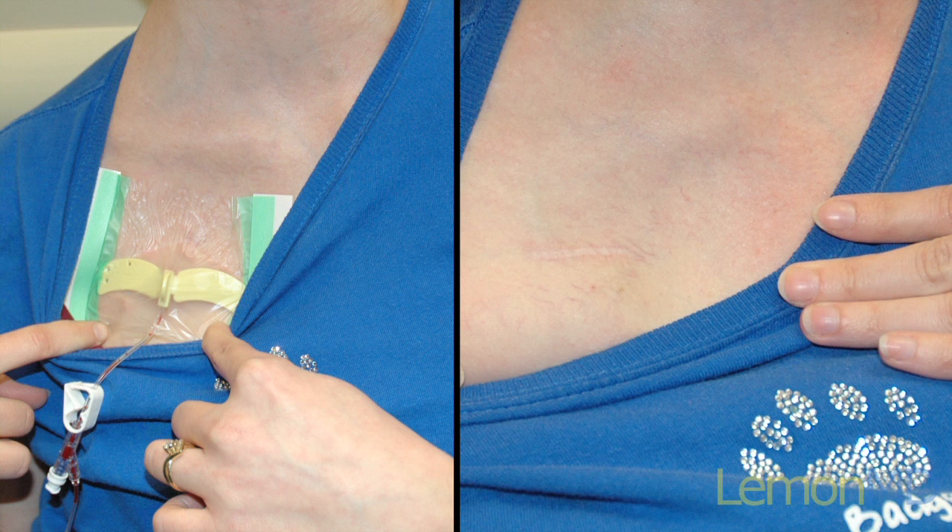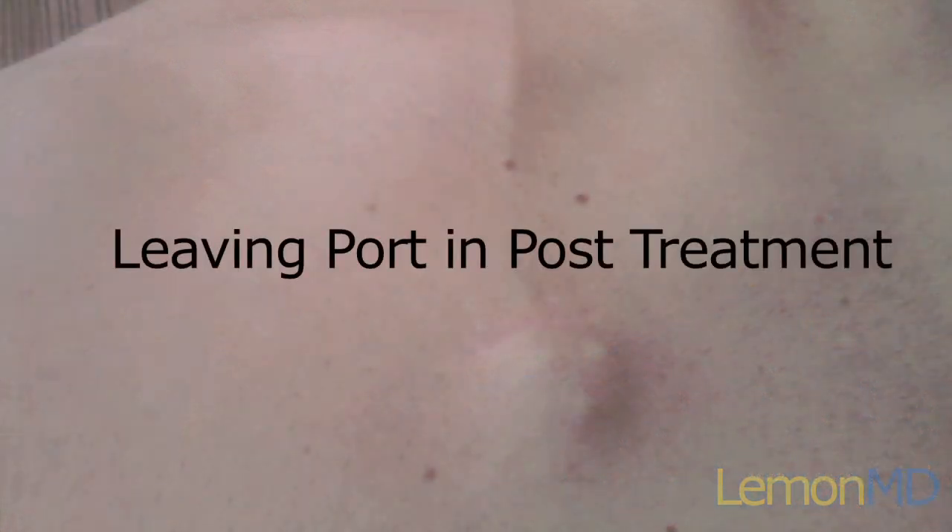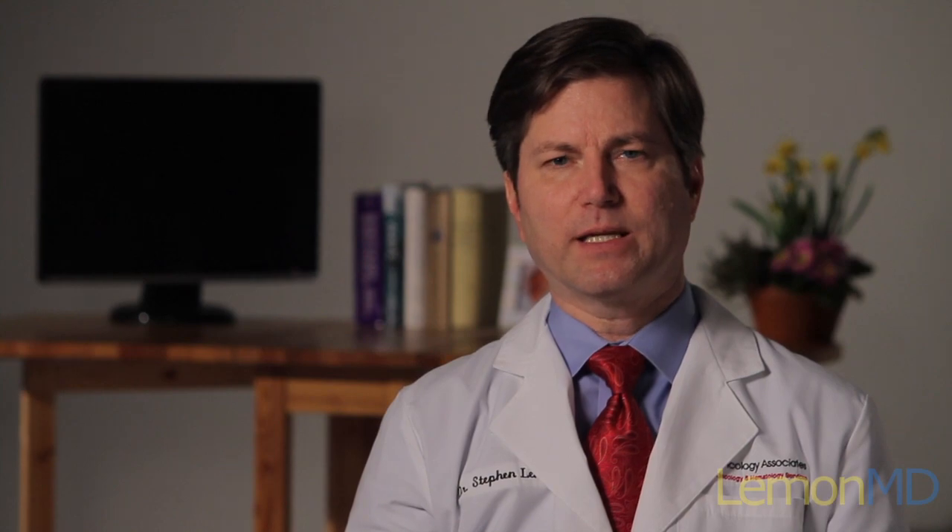Sometimes your doctor may ask you to keep the portocath in for a little bit longer in case of additional blood draws or possible additional treatments. If a portocath is going to be maintained after the completion of cancer treatment, it needs to be flushed once a month to prevent blood clots from forming in the catheter.